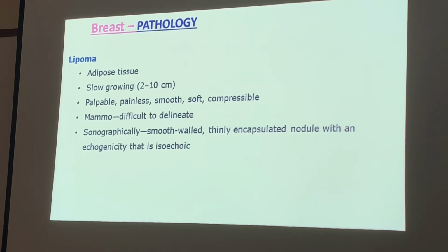Yeah, you should. Because that's the thing, you get caught up in the breast, in those cysts, and you may be able to determine them on your scan. But remember, it's all about trying to have that repetition.